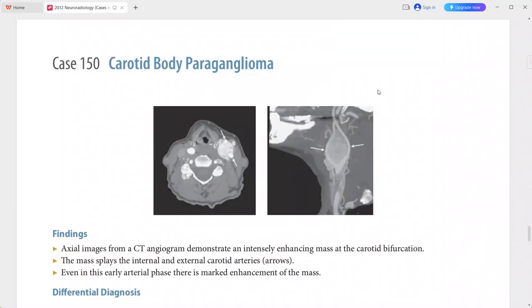The mass is causing splaying of the ICA and ECA, producing the lyre sign, which is quite characteristic for carotid body paraganglioma. This is a case of carotid body paraganglioma. Differentials include schwannoma, glomus vagale, lymphadenopathy, and aneurysm.